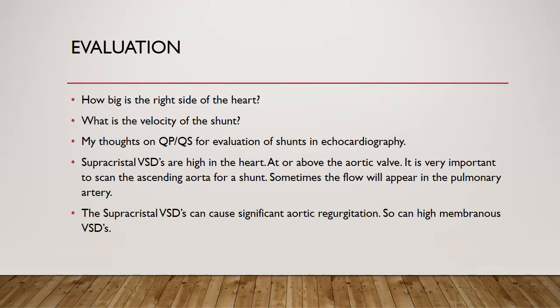My thoughts on QP/QS for evaluation of shunts in echocardiography: I think QP/QS is pretty much worthless in the world of echo. I've seen some of the most outrageous QP/QS numbers in kids with small VSDs — it just doesn't make sense. In children it's not very accurate. The last two pediatric cardiologists I worked for never wanted it because it was never accurate.